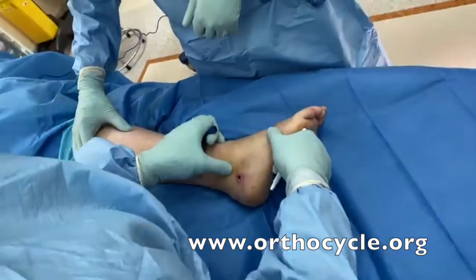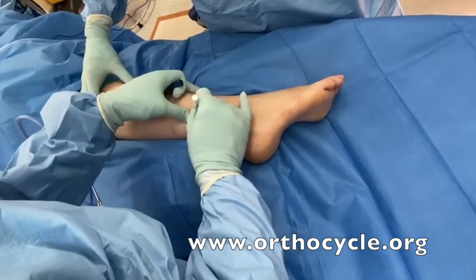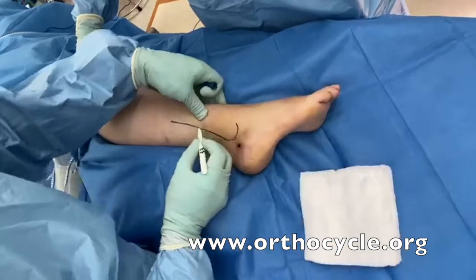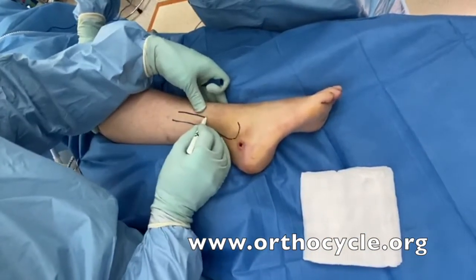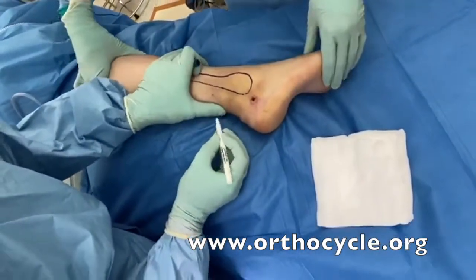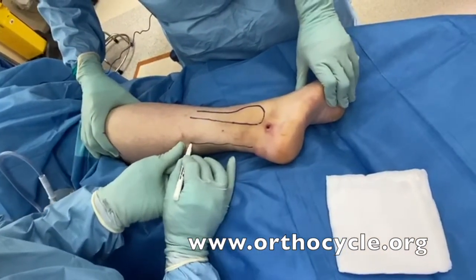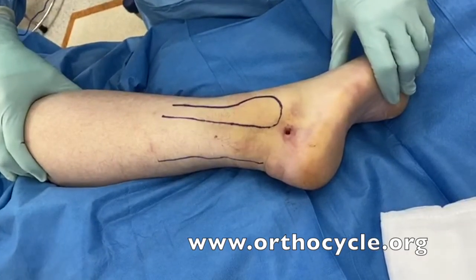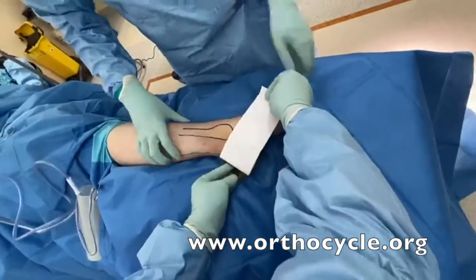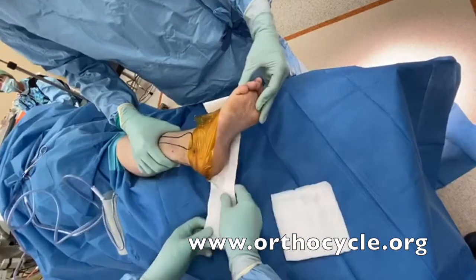I like to operate in the lateral position. The non-affected leg is bent 90 degrees so that I can get a decent image of the fractured ankle. First of all I'm going to mark on the surface anatomy — there's the edge of the fibula and then the lateral edge of the Achilles tendon. A Denham pin was put through the calcaneus as part of an A-frame external fixator, and this has left a hole after we've removed the external fixator, so we're going to cover this up with some Ioban.